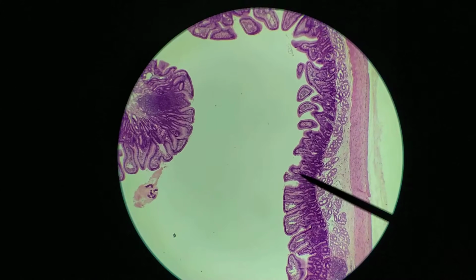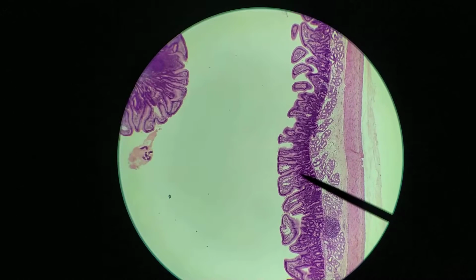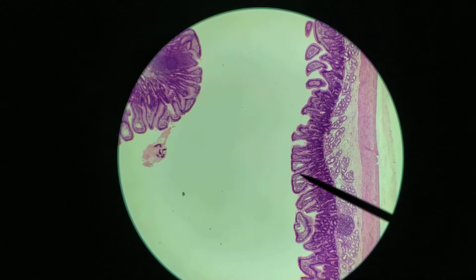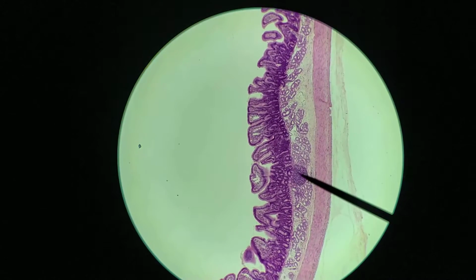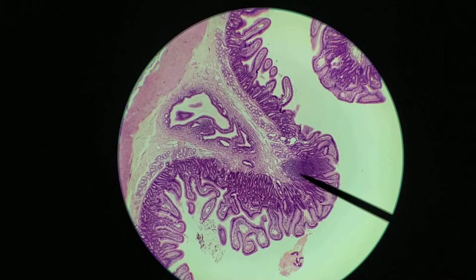Okay. Now the other thing to notice here is that this mucosa is staining very, very dark. It's very basophilic, and that's because of the abundance of lymphocytes in here. So there's a lot of lymphatic tissue in here. There's also a sign of a small nodule here. There's another nodule right here as well.